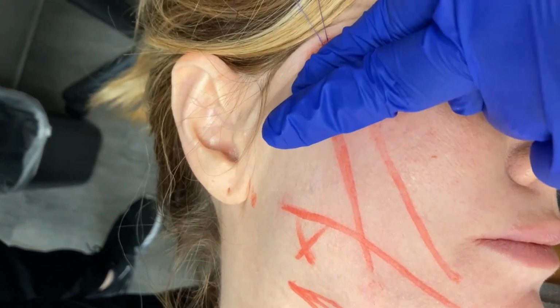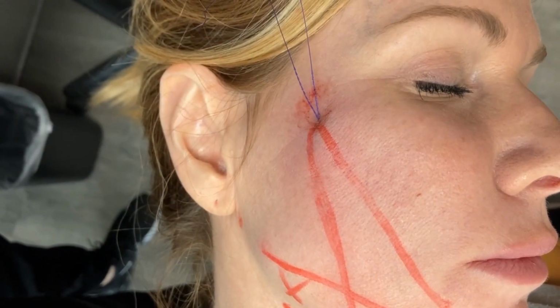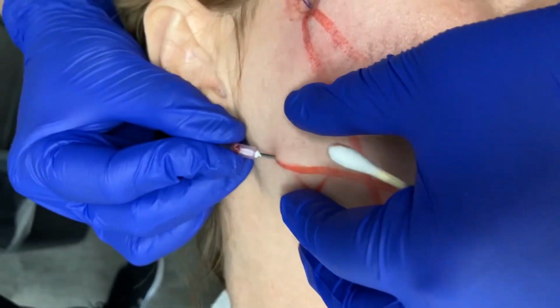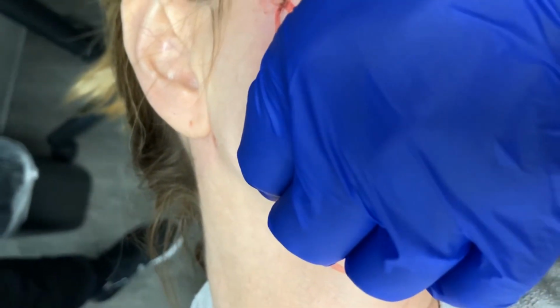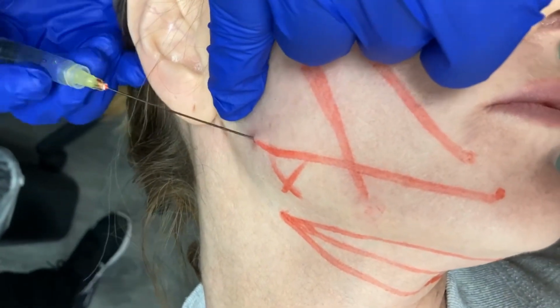2 lifting PDO threads, and look at that lift, and you'll be able to see before and afters a little bit later on, and that is all you need. Compare that to all these other threads where you would need 5 to 10 in that area to match the 2 of these V-Soft Lift threads, and you can see some of their cases for yourself. Now let's go ahead and do this jawline lift, and she was numb from before.